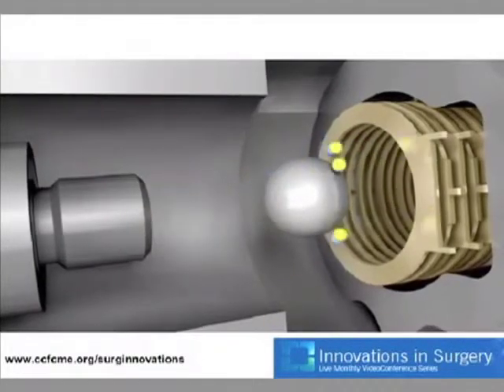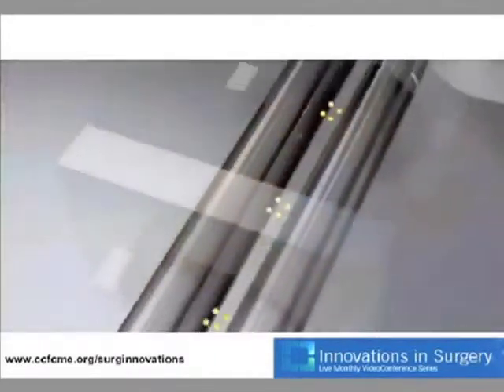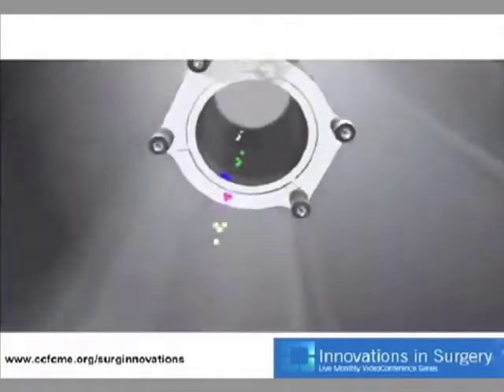Now, what happens to molecules in typical mass spectrometry is that you ionize them by firing electrons at them. We don't need to do that in surgery, as I've mentioned, because you have heat. But we will then use a number of different techniques. This is time of flight.